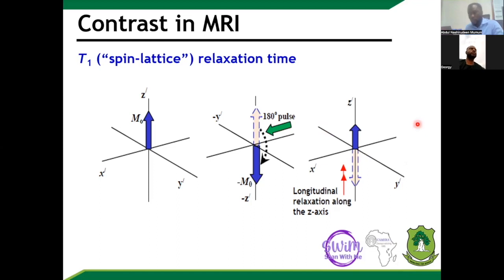And so we would call it T1 weighted. T1 weighted because it is the amount of signal we recover after we have waited for the signal to relax to a certain length. Because we've not recovered everything, it is said to be weighted by T1.